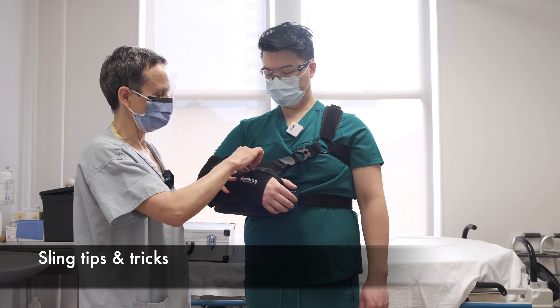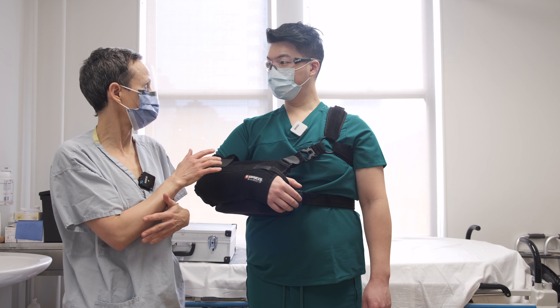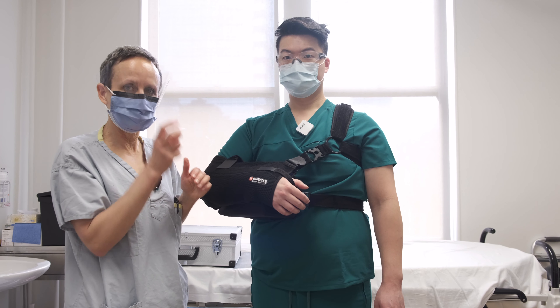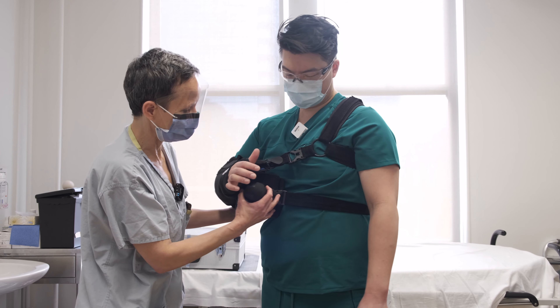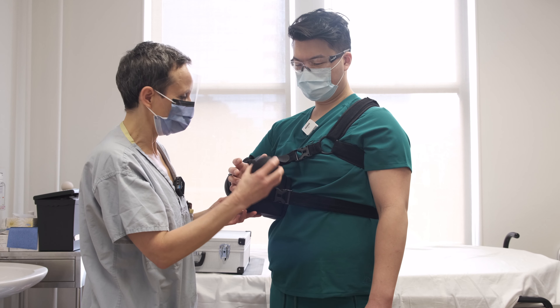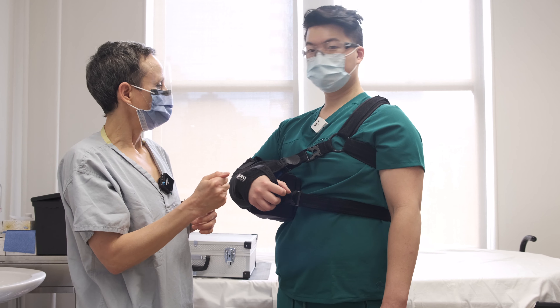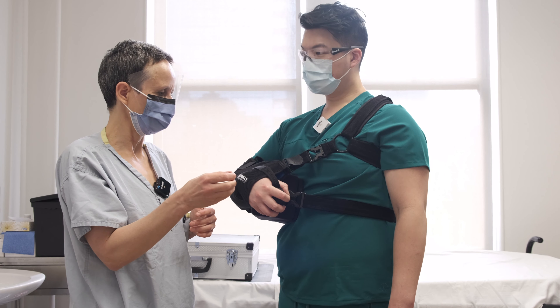Regarding the thumb strap — when you're going home from the hospital, your arm is still frozen from the anesthetic. Do not use the thumb strap yet because you won't know how much pressure you're putting on your thumb. Once everything is fully awake and you have full feeling, that's when you use it. Also, there is a little exercise ball that comes with the sling. Once you're awake and your doctor says it's okay, you can basically do physio all day — just squeeze the ball, which helps with blood flow and helps with swelling. Some patients say it actually feels better when they're holding something in their hand.